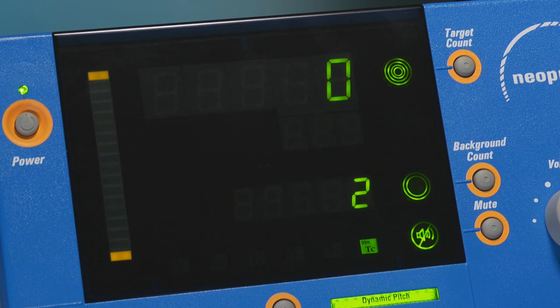Version 6.01 software adds dual isotope radionuclide selection mode and dynamic pitch only.